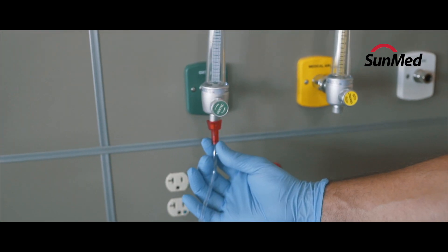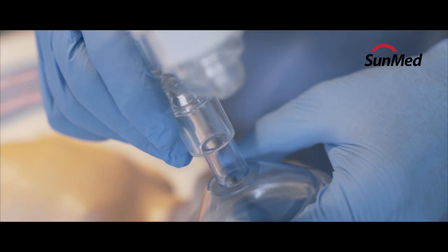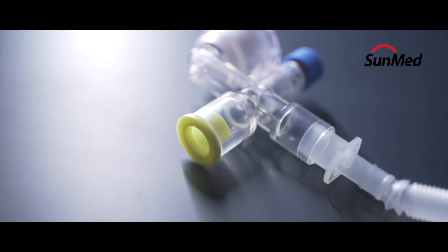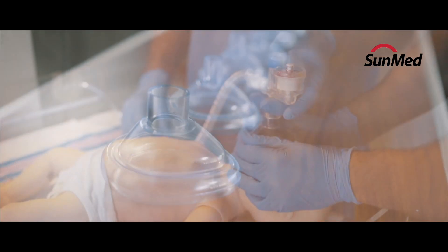The inline integrated manometer, positioned above the mask, allows both left- and right-handed clinicians to keep their eyes directly on the infant, while helping to prevent over-pressurization of babies' fragile lungs.